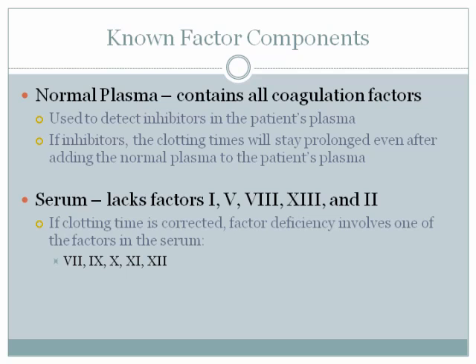When you mix a patient's plasma with serum and rerun the test and it corrects it, meaning makes that test all of a sudden a normal result, we know that the serum has contained a factor that has replaced what that patient was deficient in. So in serum, they have the factors 7, 9, 10, 11, and 12. So it's missing all the other factors. And unfortunately, you guys have to memorize this. You need to know this not only for my tests and quizzes, but also for the boards. So you must know that serum has 7, 9 through 12. That's the way I remember it.